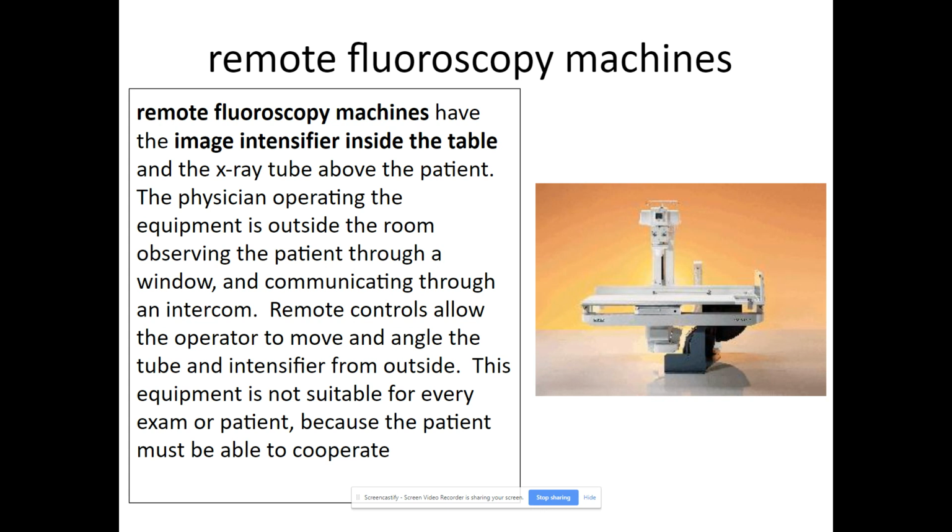And you can move the table back and forth and do all this stuff from outside the room. Not so good if the patient can't understand or is unable to do what needs to be done. Right? Then you're kind of back to the drawing board anyway. That's really the only difference.